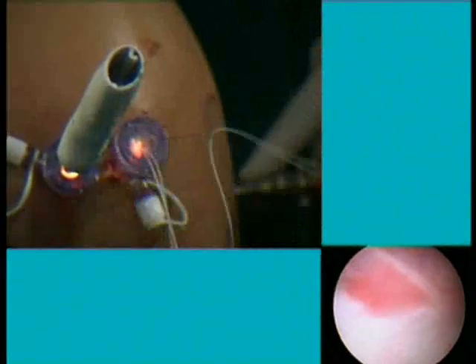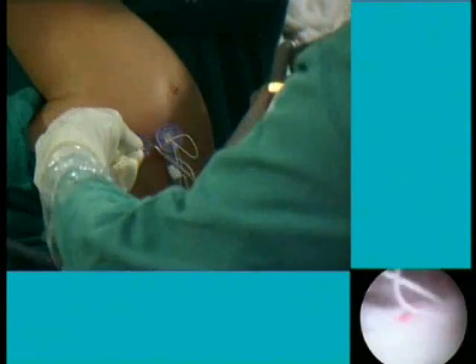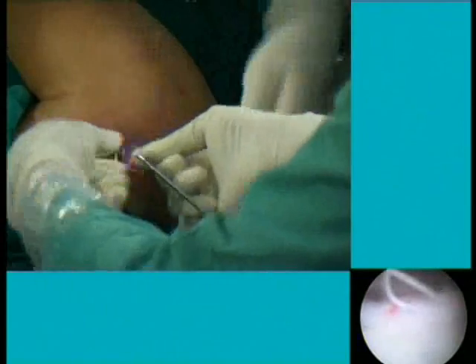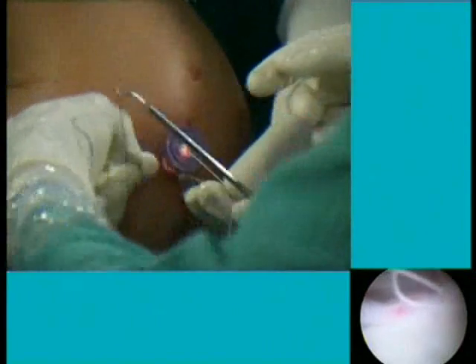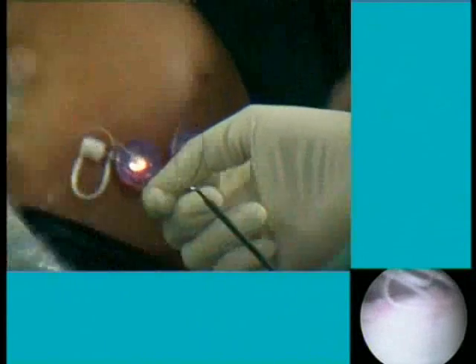What kind of knots will you be applying? I use a sliding locking knot, and I use a Nicky's knot. Nicky's knot, right. It is quick and small, and it is equally effective. So we are shuttling one of these sutures.